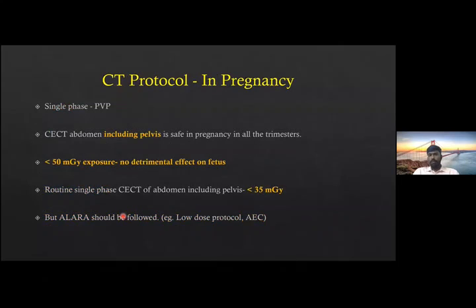So, CT protocol in pregnancy. Pregnant patients with trauma is a difficult combination for everybody, both the surgeons and the radiologists. However, a CT abdomen, including a single phase CT abdomen including pelvis, is considered safe in pregnancy in all the trimesters, considering the risk-benefit ratio, and the recommendation of less than 50 milligray exposure is fine.